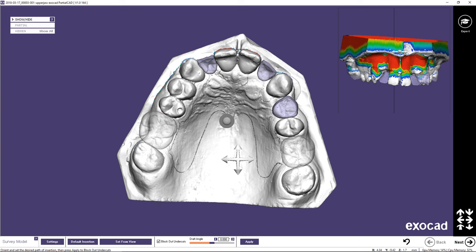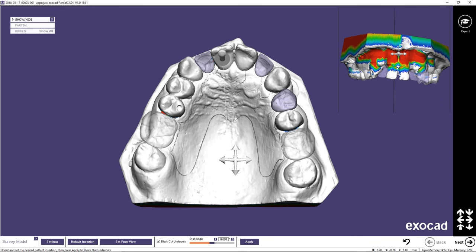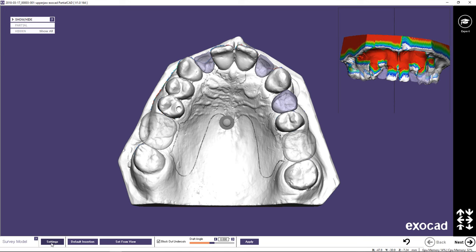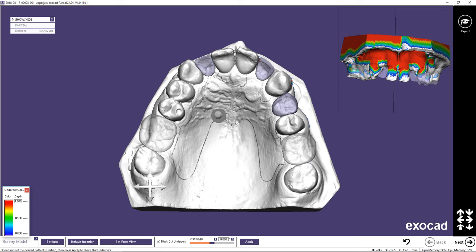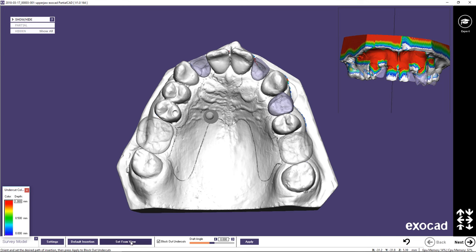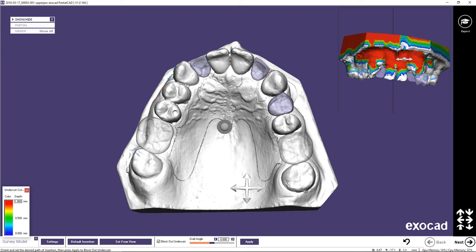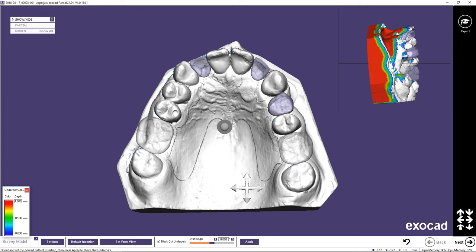In the first step, Survey Model, position your model so you are looking at the occlusal surface. To view the key for the undercut color mapping, click on the Settings option. Move the model to adjust the undercut — tip it forward to increase the mesial undercut, or backward to increase the distal undercut. Click Set from View to set the insertion direction and see the undercut changes. Use hotkeys F6 through F8 to change the perspective in the alternate view window. The draft angle can be changed using the arrows or by typing in a value. Clicking Apply can be skipped as hitting Next will automatically apply the survey wax.